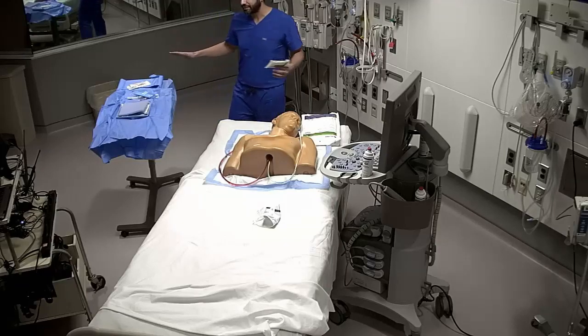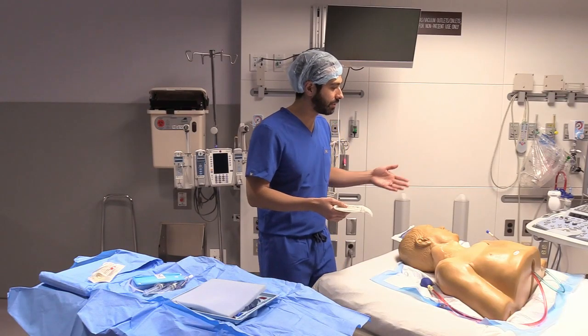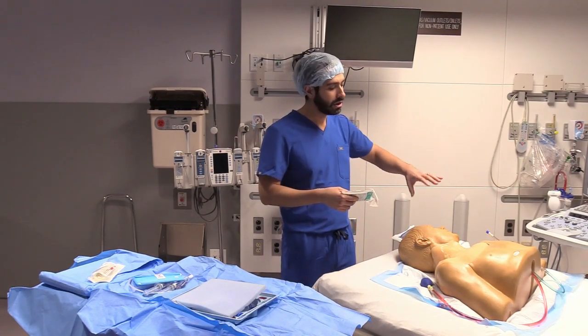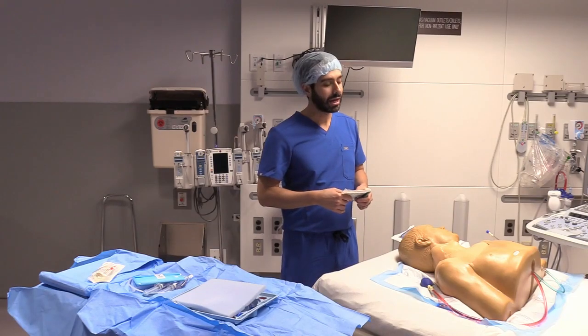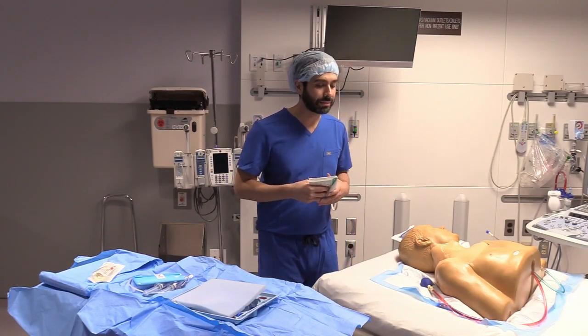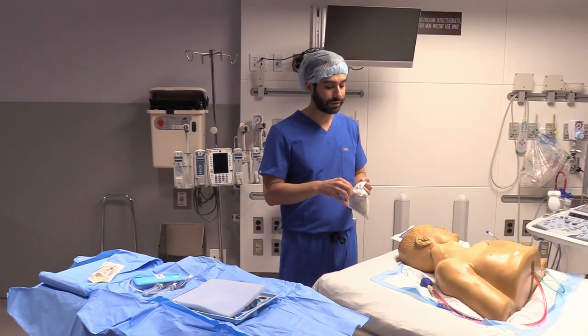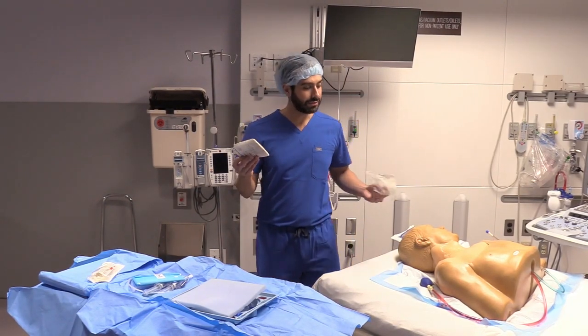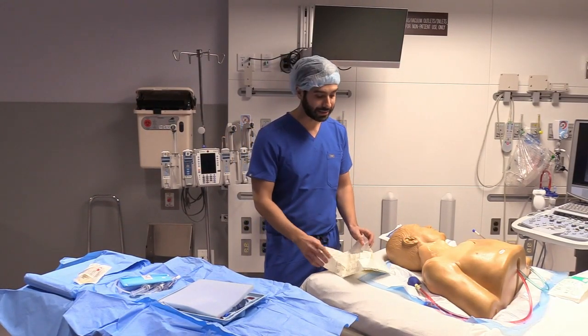It's really nice to have this area completely clear of anything before you start. Obviously, if the ventilator's here, you like the ventilator on the left side so the tubing can go over that way versus draping over where you're going to be placing the catheter. So I think that is the most optimal positioning of the patient and getting everything organized before you start. Then I'll open my gloves and have my gloves open on the bed, either in front of me or somewhere nearby on the table.